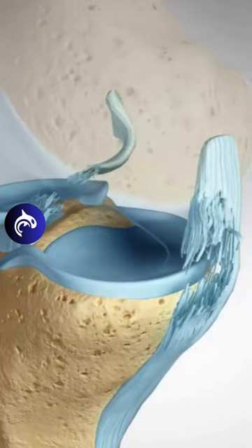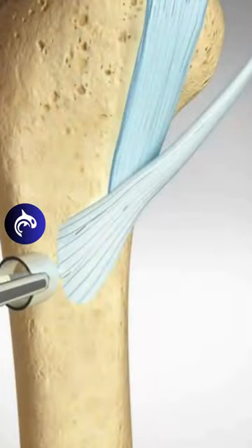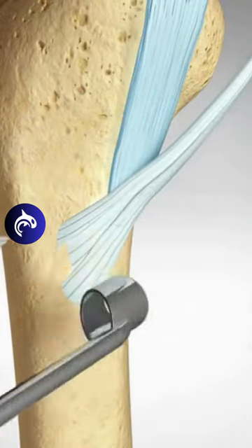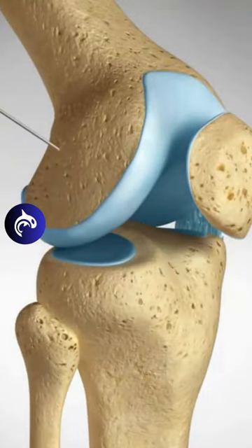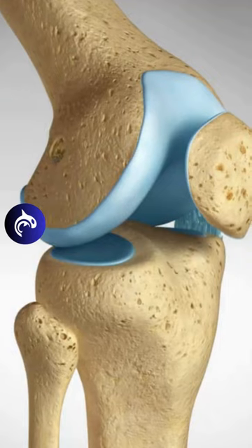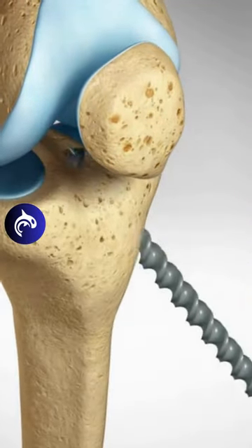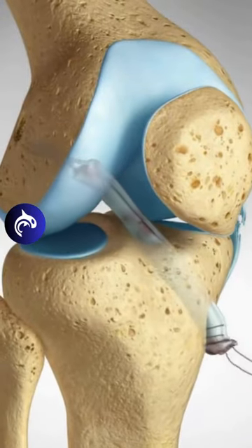A torn ACL requires reconstruction. A tendon graft is taken from the patient and the torn ligament is removed. The surgeon will drill tunnels into the thigh bone, or femur, and the shin bone, or tibia. The graft is then secured with screws or other devices.